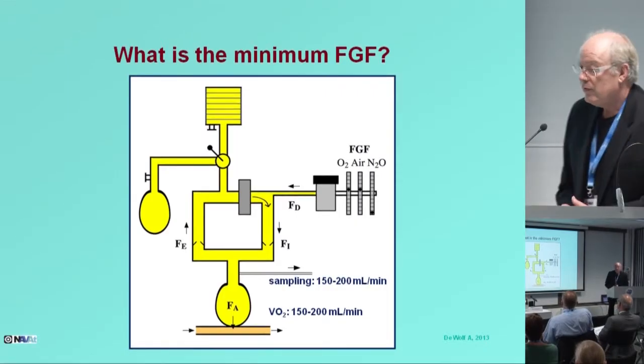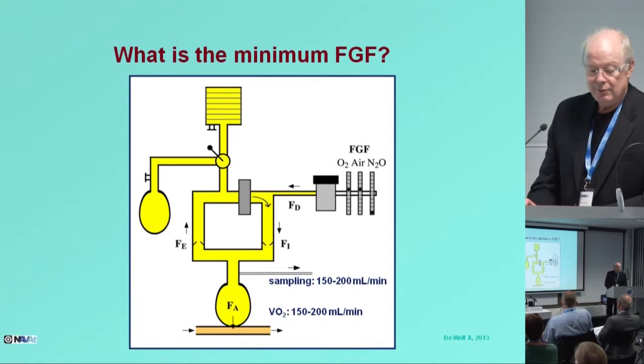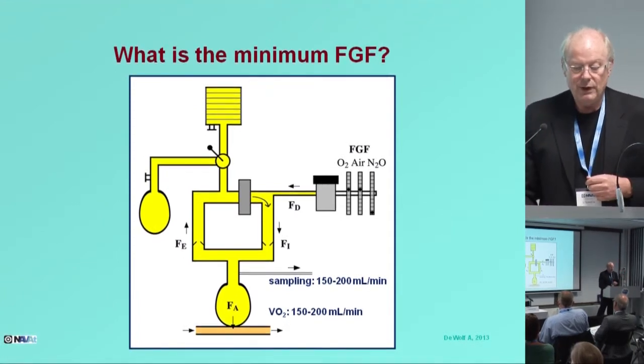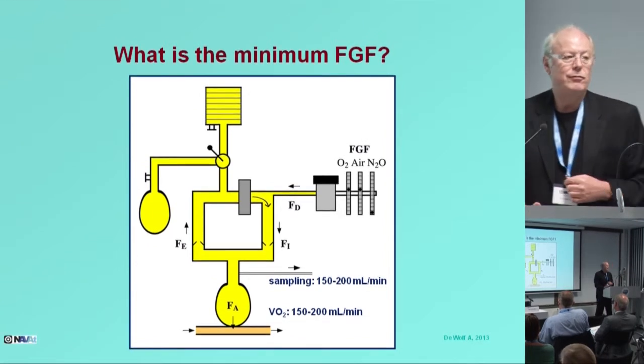Well, our anesthesia system can be considered to be two reservoirs. On one hand, you have the bellows of the ventilator. On the other hand, you have the FRC of the patient. And what our anesthesia machine does is, based on these two reservoirs, we pump gas from one reservoir into the other. That's our minute ventilation. And we keep doing that the whole time.